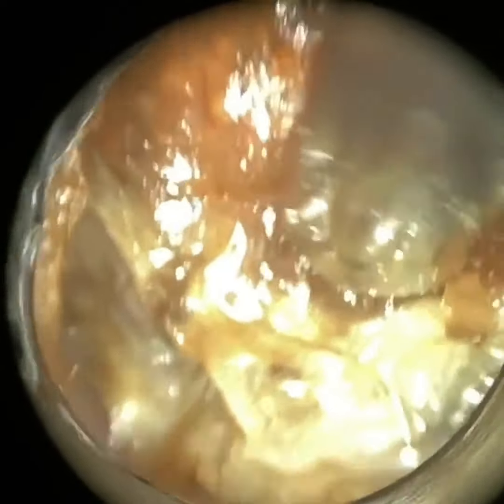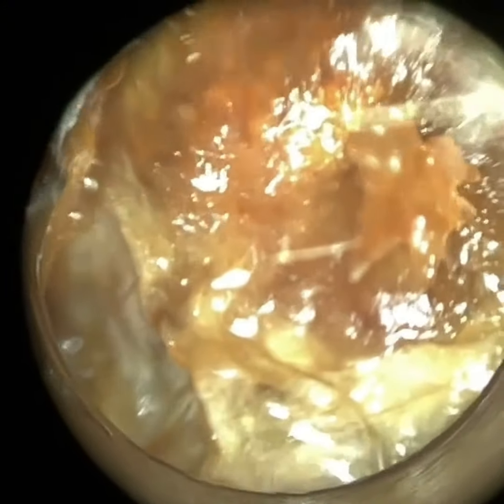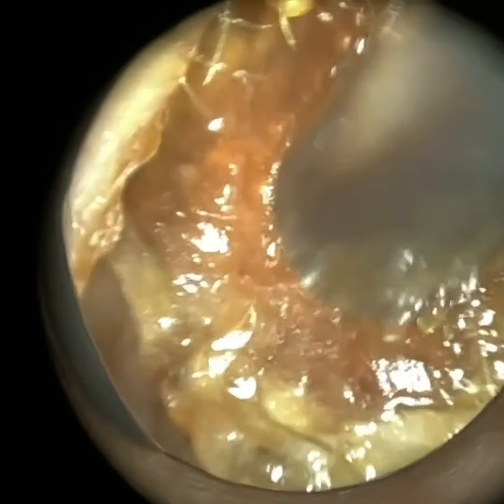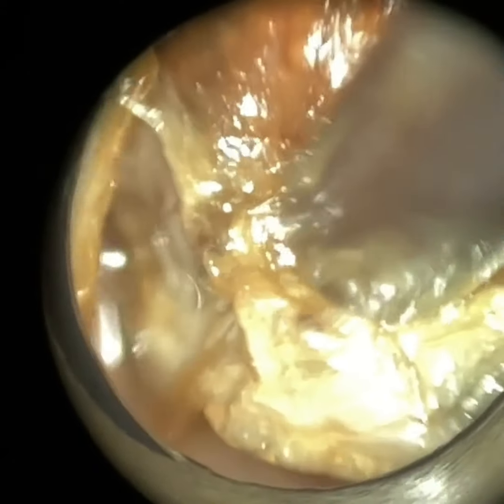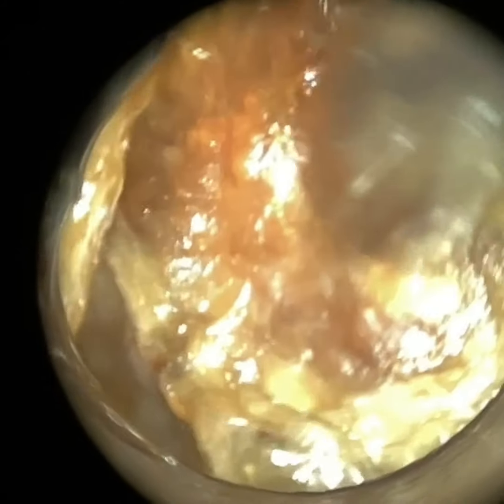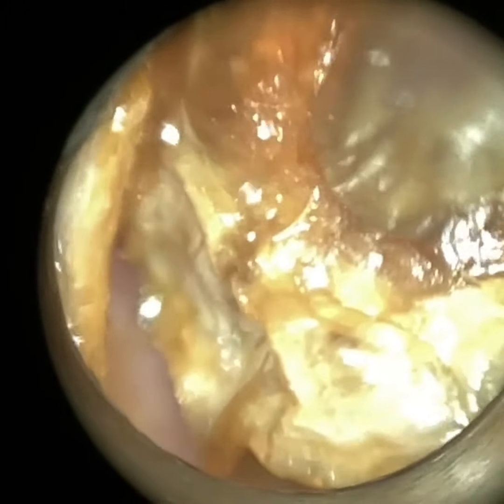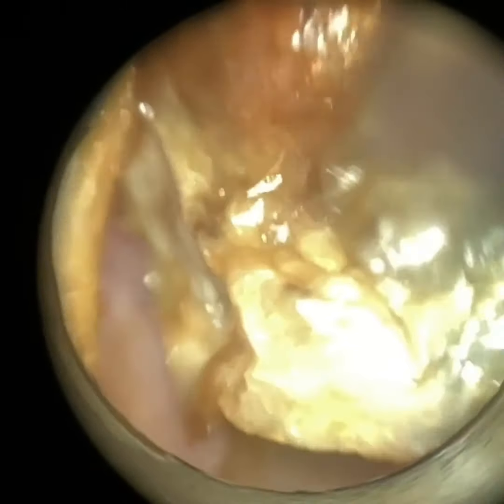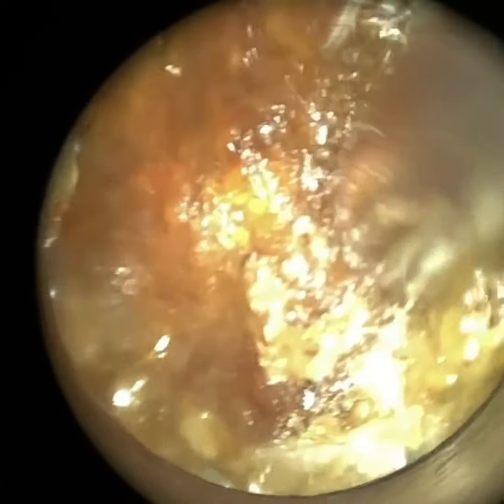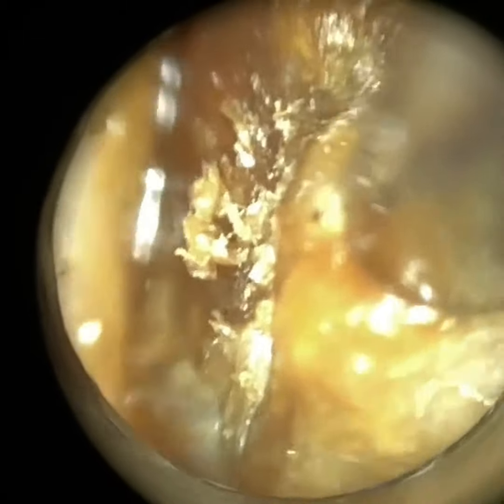There was just no way I was going to remove this with that online USB endoscope — with that silicone tip it's so floppy, and this wax is rock solid. The left side — I performed the left procedure first actually, I edited the right one to show you first. I managed to get a bit of a suction grip here and you can just see how large this is. I had to angle it because the entrance is a bit bendy, going to the back part of the wax plug. There's a lot of keratin, a lot of dead skin here, which is why it's really reflective. I had to angle this and kind of curve it around between the first and second bend.